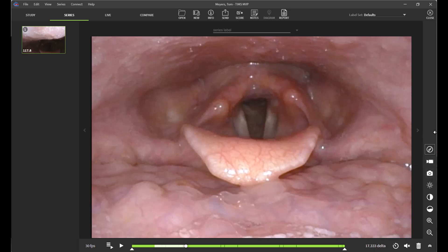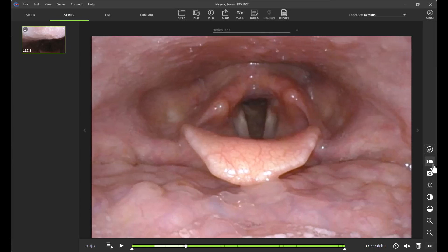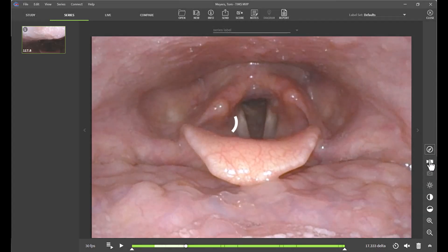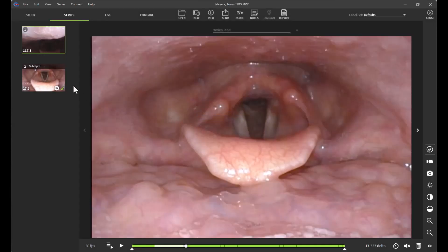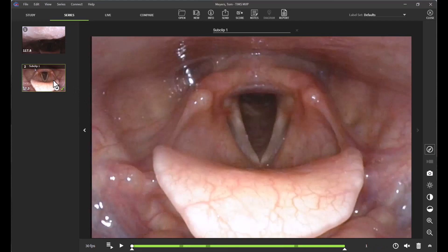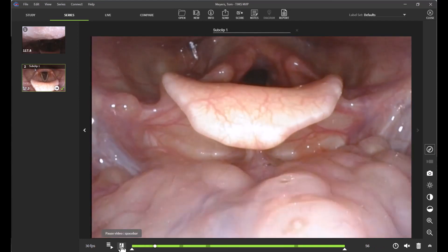If you don't see the camcorder icon, go ahead and open your toolbar by clicking the arrow here. I'm going to go ahead and click my camcorder, and as I do so, I am prompted to label this. I'm going to label this sub clip one and click OK. Now on my left-hand side of the screen, you can see that I have a shorter sub clip and I can go ahead and play through it.